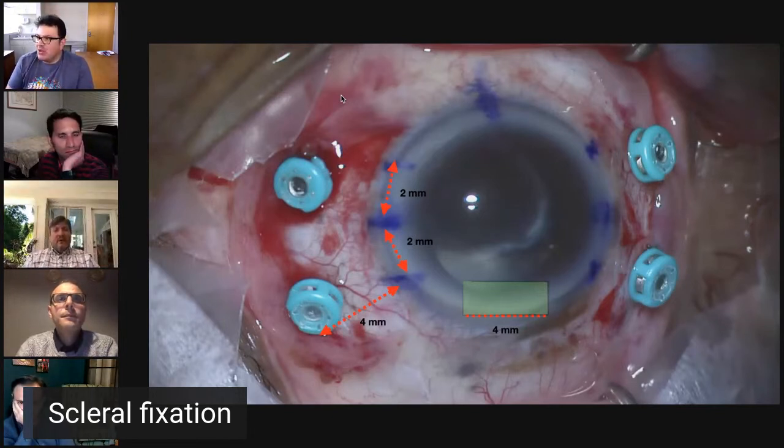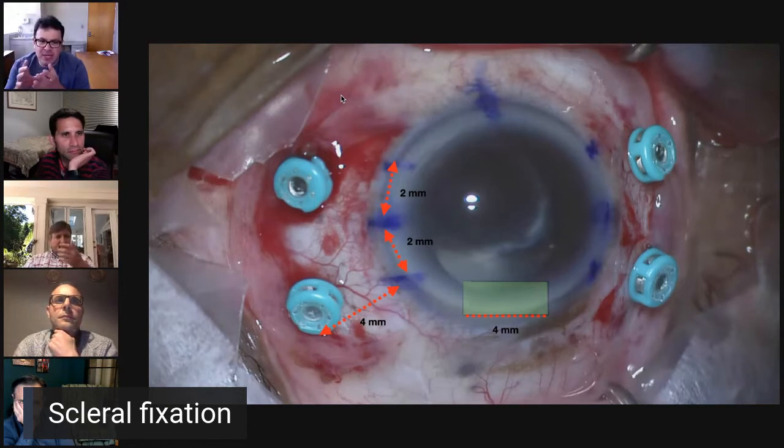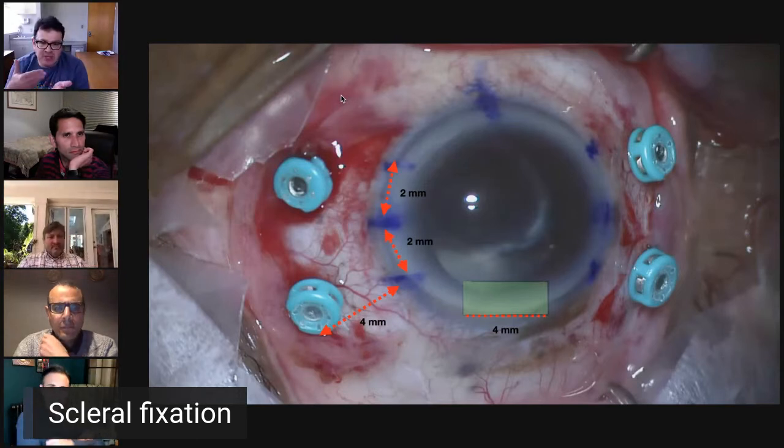So this is the way I do it, and I try to make things easy for myself. I make marks and go about 2 millimeters from each mark, and I go backward 4 millimeters to get iris clearance, because this is actually a one piece lens. You don't want this to be chafing against the iris. And I use an in the bag calculation. So that's what I tend to do.